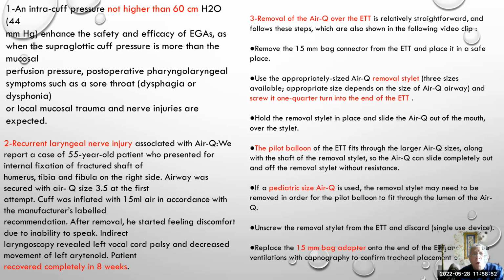Now, of course, we also assess the supraglottic laryngeal mask meanwhile during creating a cricoid pressure, which we use to minimize the leak. And they found that there are different performances of different types of supraglottic devices regarding cricoid pressure. Also, they used the supraglottic during CPR, and they measured the oropharyngeal leak pressure, which is the pressure during inflation, compression, and during release of the device, to evaluate different types of supraglottic laryngeal mask.